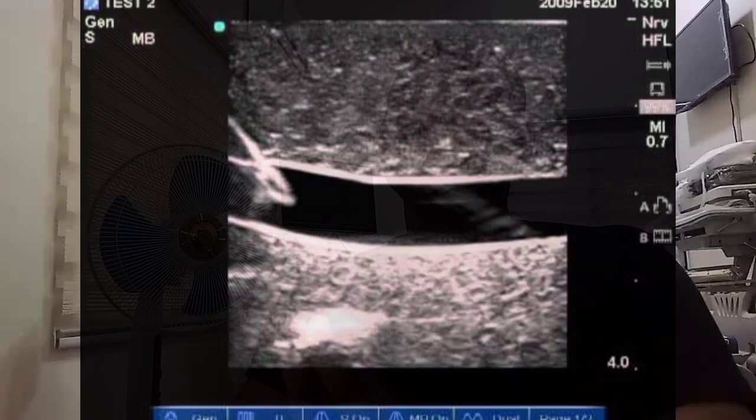However, if the blood flow velocity is sufficiently slowed, blood flow echoes may be seen in blood vessels, especially due to red blood cell aggregation, which forms a larger effective scattering target and produces an echo which is sufficiently strong to be detected and displayed.